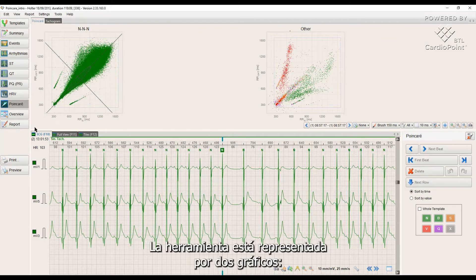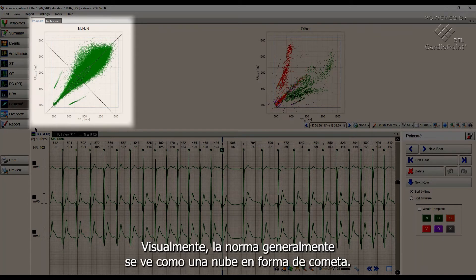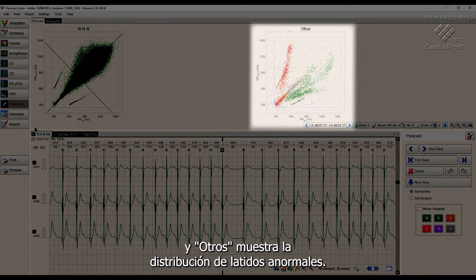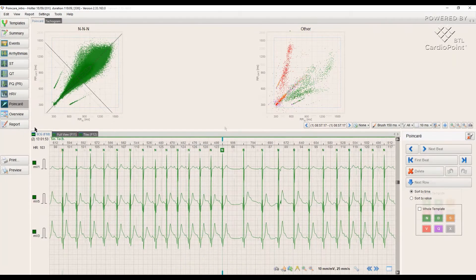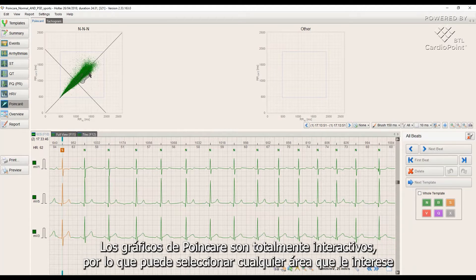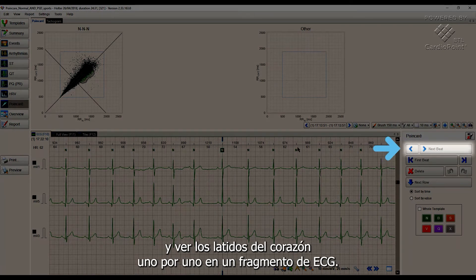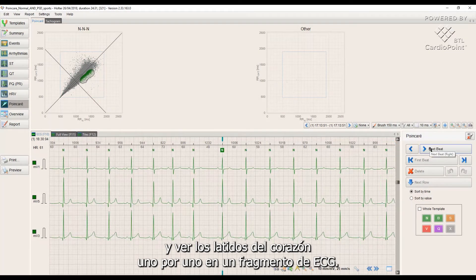The tool is represented by two graphs. NNN shows the distribution of normal complexes — visually, the norm usually looks like a cloud in the shape of a comet. The 'Other' graph shows the distribution of abnormal beats. In the first example, there is a recording without any abnormal findings, so we see beats only in the NNN graph. Poincare graphs are fully interactive, so you can select any area you are interested in and view the heartbeats one by one on an ECG fragment.